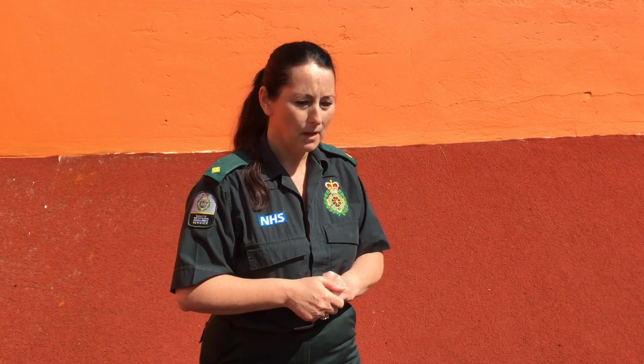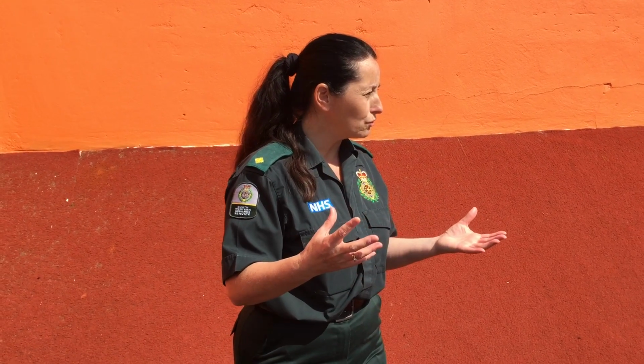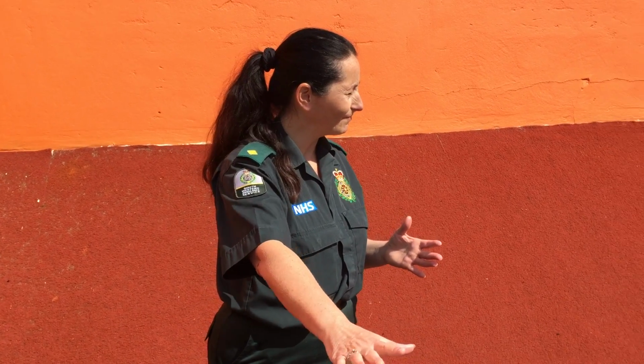So it could still be attached to the person, just elsewhere, not touching. So lift it up over the head or something. If that's difficult, and you're handy somewhere where you've got scissors or whatever, just cut it off. What you have to remember is you're going to save the ambulance crew's job when they arrive, because they want to see a clear, bare chest. So that's all the safety implications you have to remember.